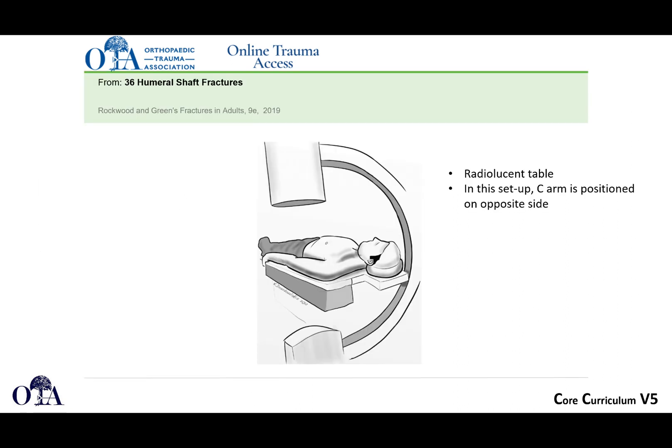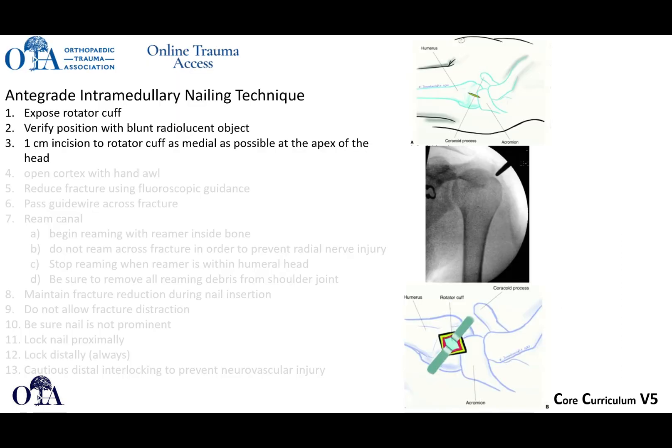When doing an intramedullary nail, you'll want to use a radiolucent table. In this particular setup, you can see C-arm position on the opposite side of the patient. With the technique, you're going to do a proximal exposure, expose the rotator cuff, verify your position with a blunt radiolucent object, make a one-centimeter incision to the rotator cuff as medial as possible at the apex of the head. Depending on your nail design, the entry portal may vary.